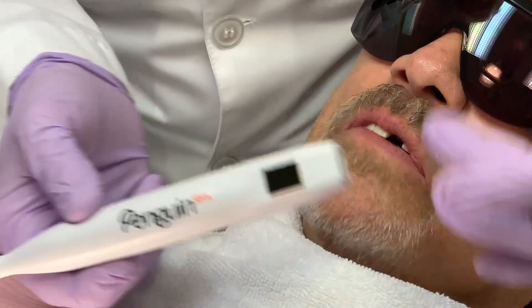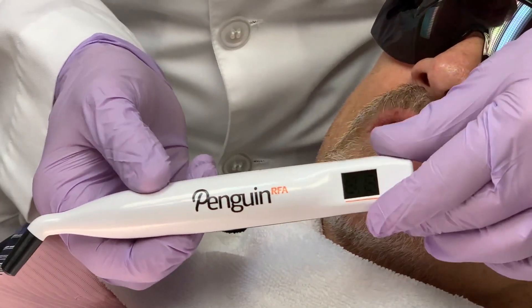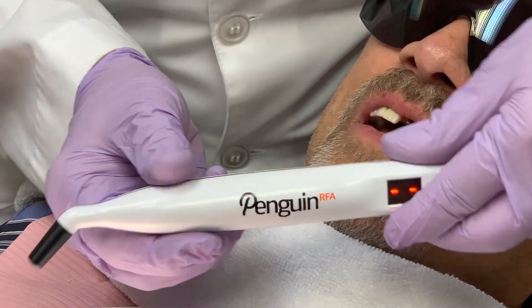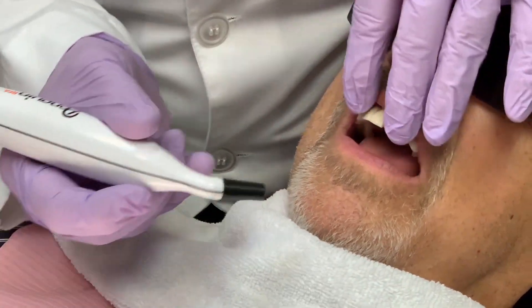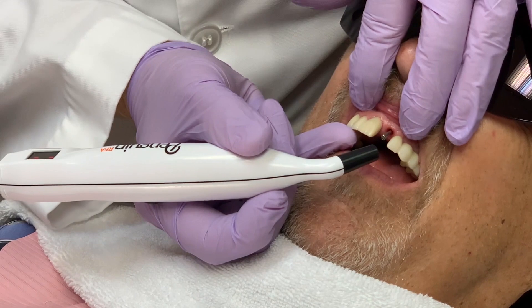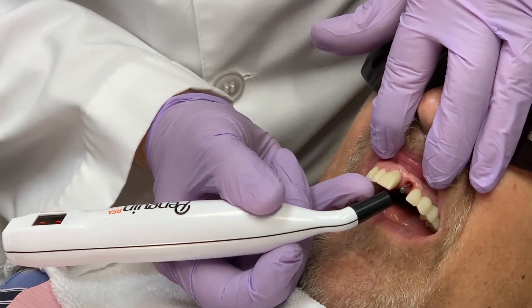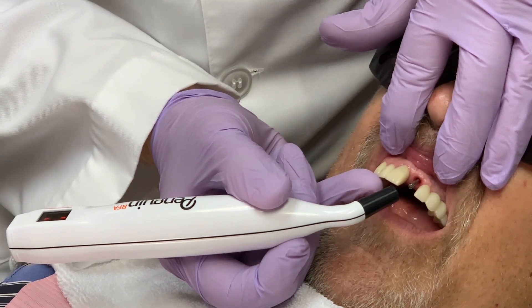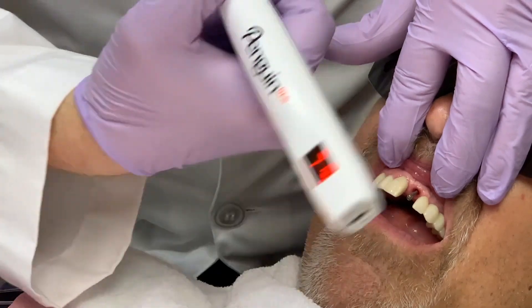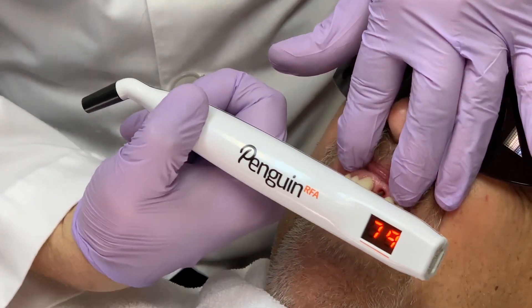To take the stability measurement, I connect this multi-peg to the implant, then turn the Penguin on and direct it toward the magnet at the top of the peg. I'm not touching it — the peg is stimulated by magnetic pulses and vibrates due to the stiffness in the contact area between the bone and the implant interface. Our value is 79.